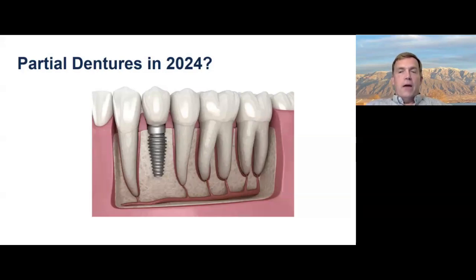You'll oftentimes have patients as well who may have a cleft palate or large post-surgical defects if they've had cancer treatment or something like that. And then partials can be a great tool for them. Not only that, but even with implant dentistry, a lot of times we'll be using a partial denture as a temporary prosthesis, either while the implant is healing or if the patient is too young to have implants placed or something like that.